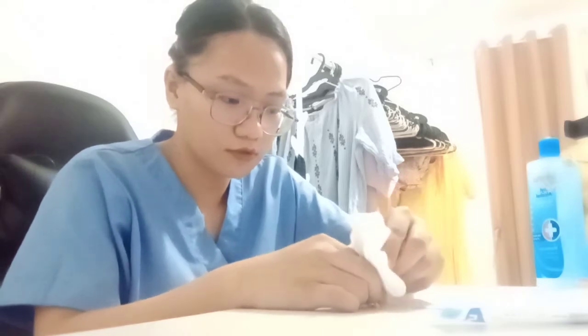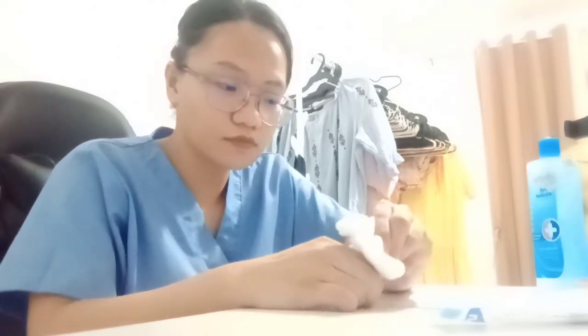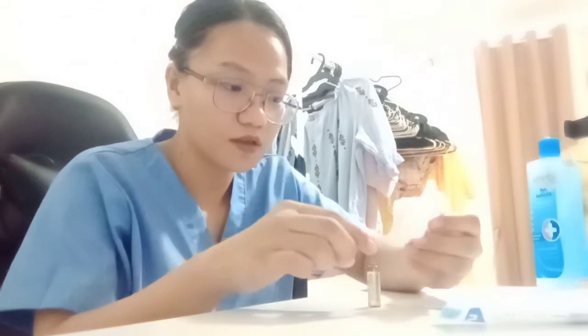Next is to use a sterile gauze or ampule opener. Since we have sterile gauze between your thumb and the neck of the ampule, break the ampule by bending it towards you. Next, dispose of the broken glass or the top of the ampule in the required container.